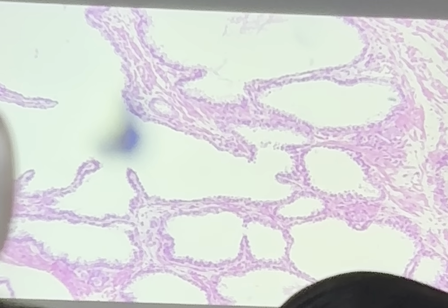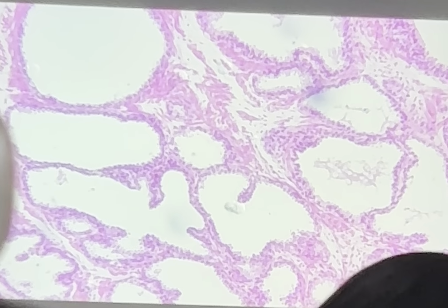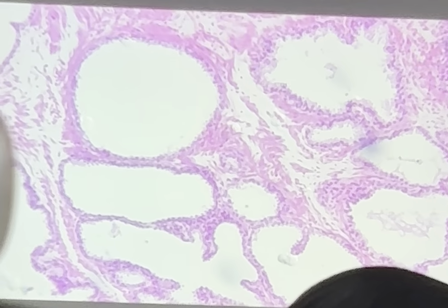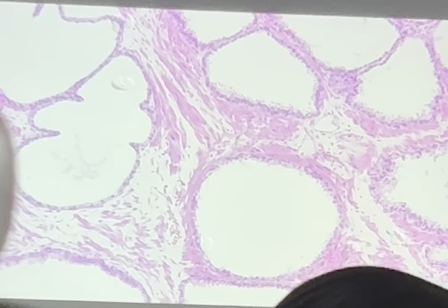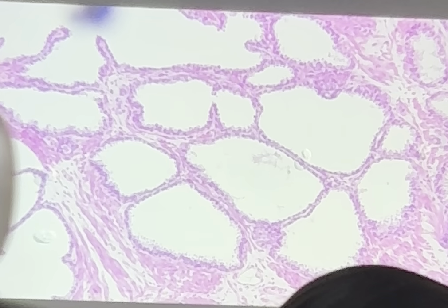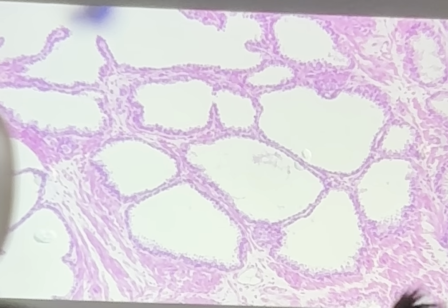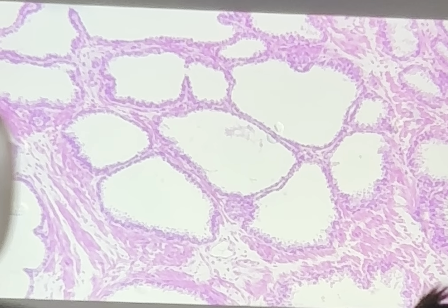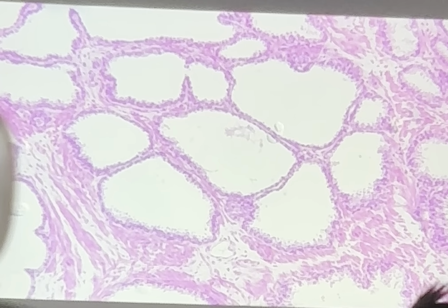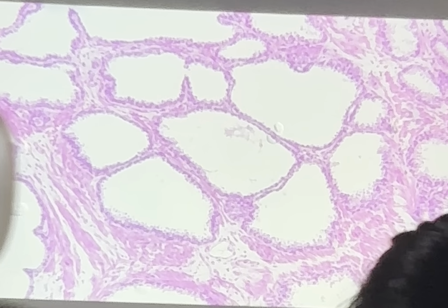Do you know what organ this is? This is actually the prostate. The prostate. You've actually seen this in the lab because some of our slides in histo have this condition. So what's your diagnosis? Benign prostatic hyperplasia. Because in the normal glands, remember they're supposed to be small and undulating. They're no longer undulating because they multiplied and they're stretched out. So this is BPH. And the problem with this, because these glands are growing and pushing the tissue to the side, it also compresses the prostatic urethra, therefore causing urinary obstruction.